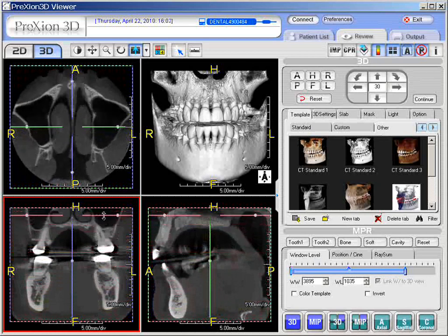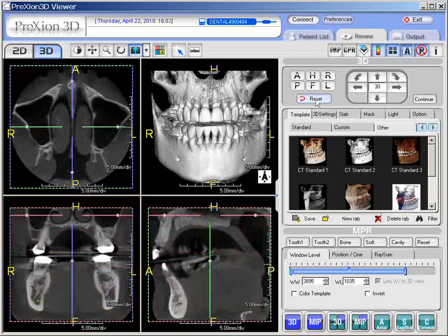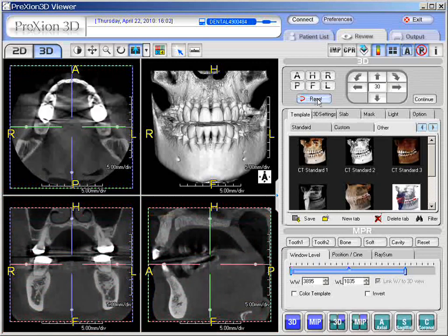Now, to reset the position, one simply needs to click the reset button right here, and that resets back to the default position.